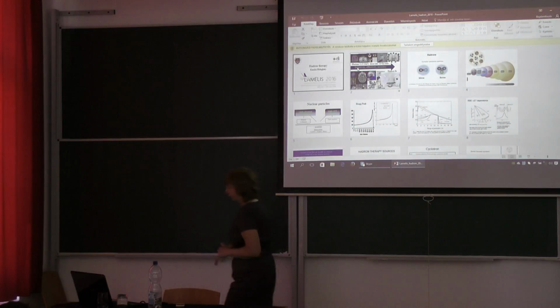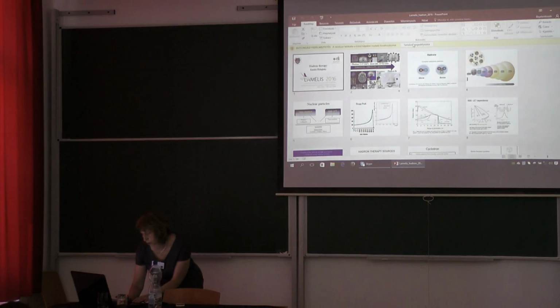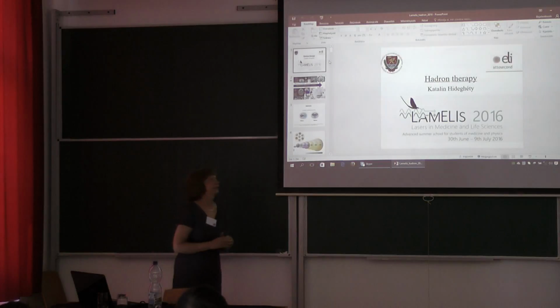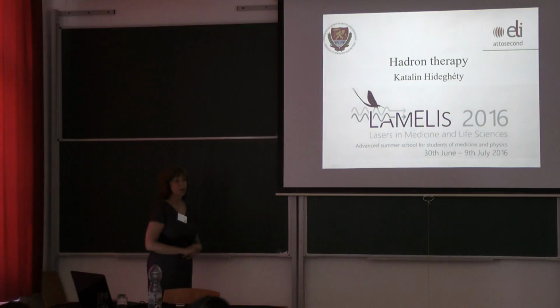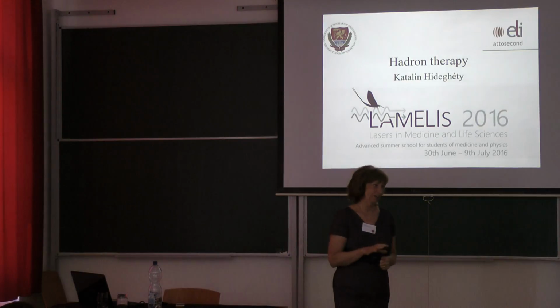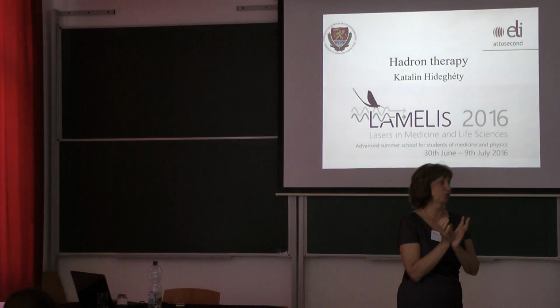Thank you. And I have not mentioned, but there are approaches to develop automatic segmentation tools by informatics, and this may help us. One such development I have seen started by getting the metabolic data from PET-CT and then using the MRI data for head and neck to really define the contour of this volume.